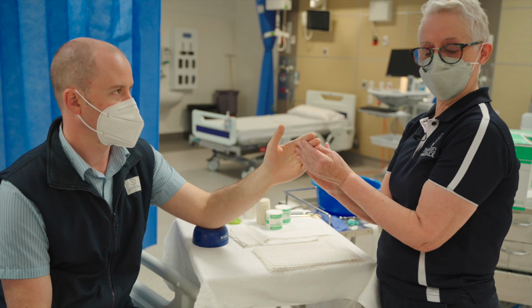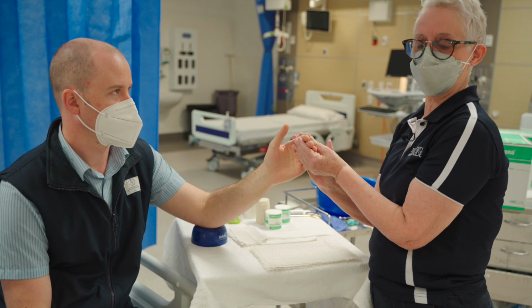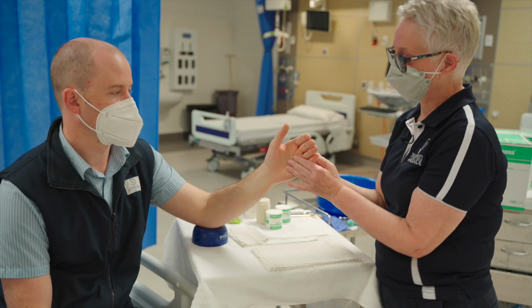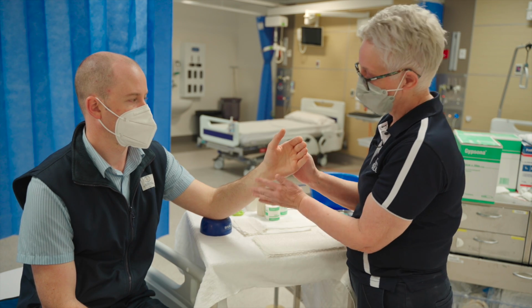What we need to do here is make sure that they are neurovascularly intact. So we're feeling for warmth or coolness in the arm. If we find that the arm is cool and sweaty, we need to stop what we're doing and seek further help. If the hand is nice and warm and the skin colour is good, then continue on.